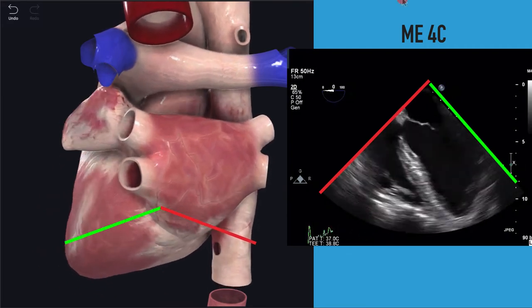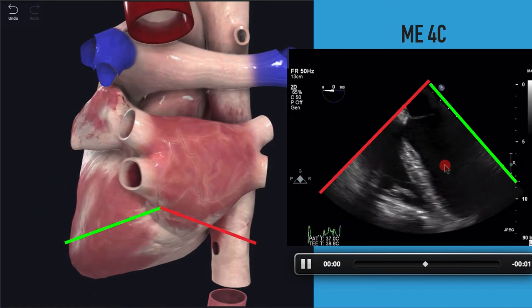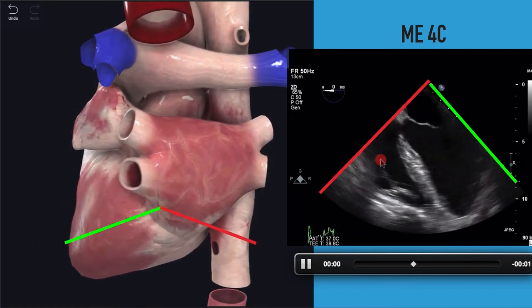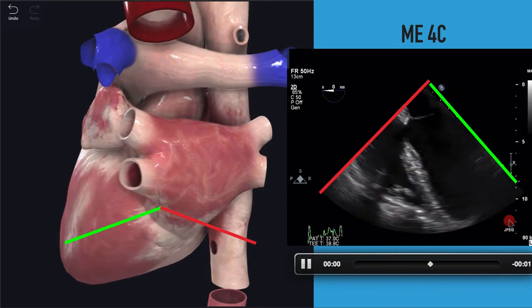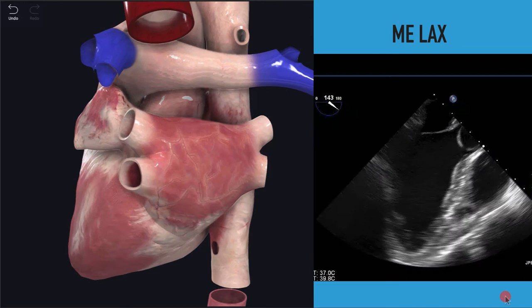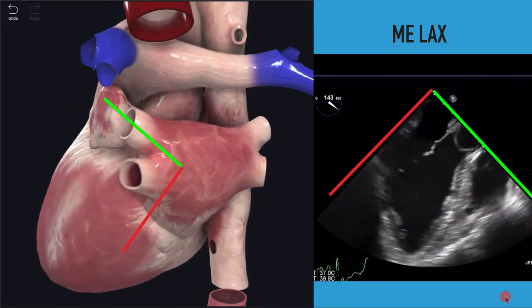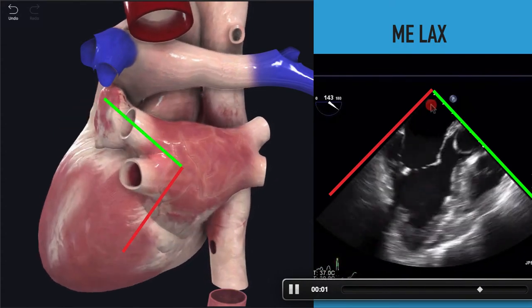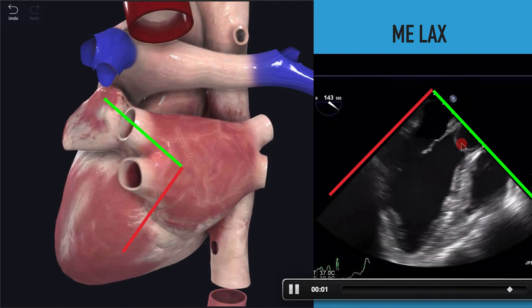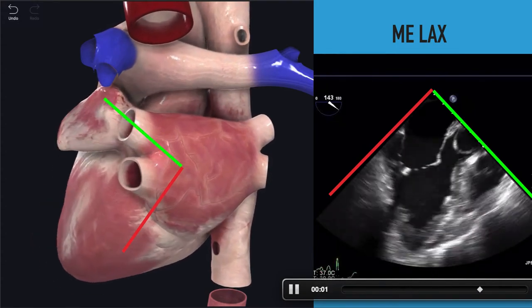So in the mid-esophageal four-chamber view, at the top near the transducer is the left atrium, then the mitral valve, then the left ventricle. The right atrium is a little bit difficult to see, but the right ventricle is down here. You get a nice view of all four chambers — really analogous to our apical four-chamber view. If we rotate to about 120 to 140 degrees with the omniplane, we get into the mid-esophageal long-axis view. The top of the screen is always the left atrium in the mid-esophageal — then the left ventricle, aortic outflow tract, aortic valve, and right ventricle. This should look very similar to your parasternal long-axis view.